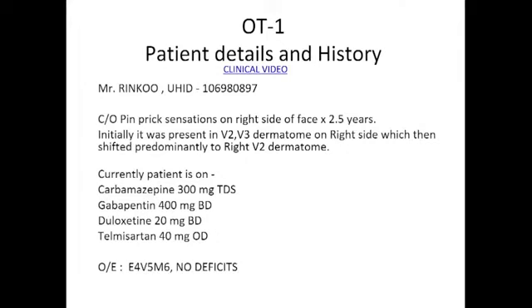So you don't give any kind of sedation while quickly finding the foramen, and the patient is having a lot of pain. Sir, you are not going to do any motor stimulation? I do it for P3 now, because once he's sedated for P3 I will show you that. Say for 60 seconds.